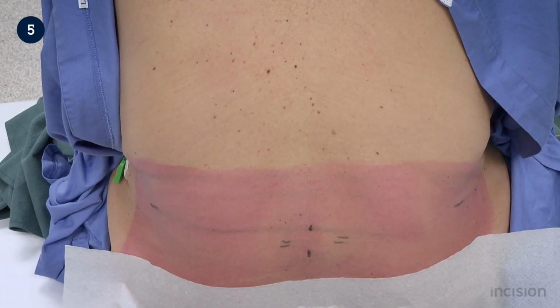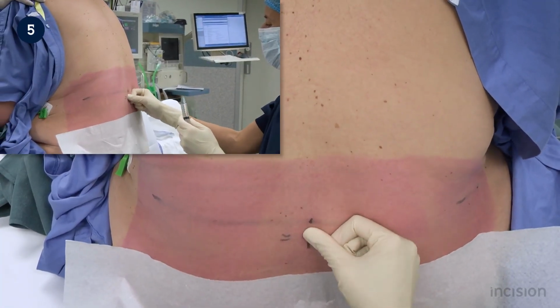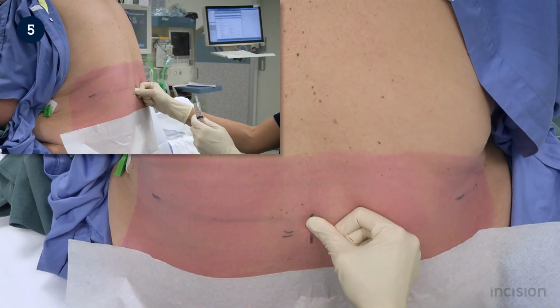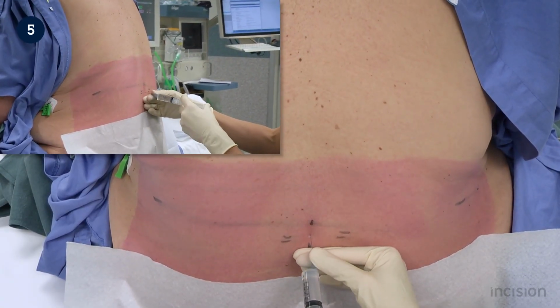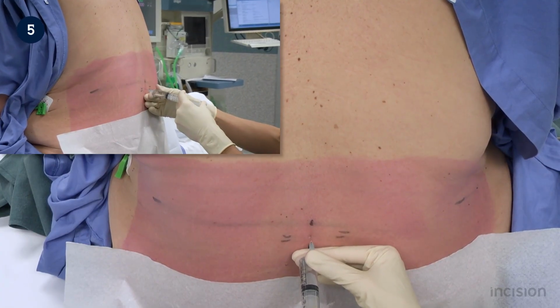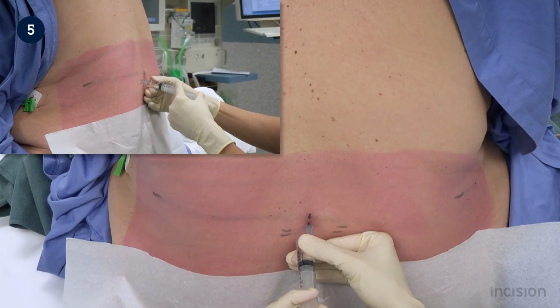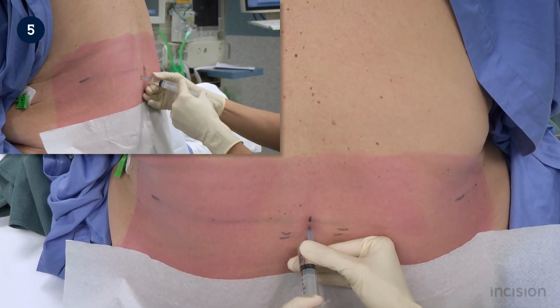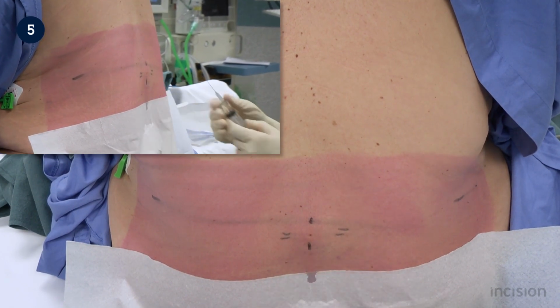Advancement of the spinal needle will be demonstrated using two camera angles. The anaesthetist again palpates the desired interspinous space. Local anaesthetic lignocaine 1% is infiltrated into the skin and the underlying subcutaneous tissue. The needle is inserted into the skin and the subcutaneous tissue in its entirety, and infiltration is again performed as the needle is withdrawn.